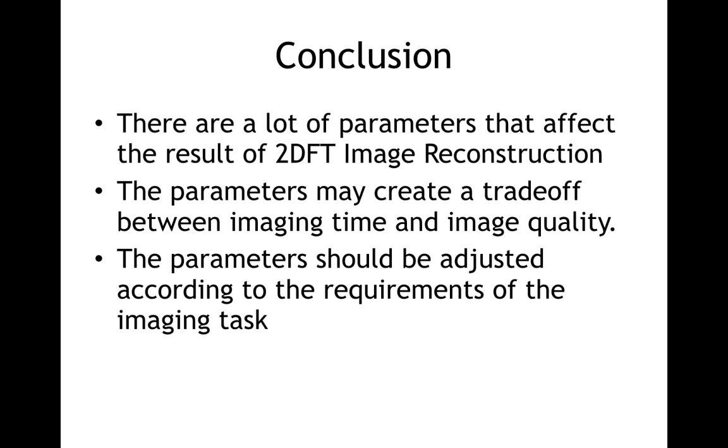Decreasing the resolution or the field of view may result in a lower quality image, however they gain on the imaging time, both in real life and in MATLAB. Sometimes faster imaging may be needed, therefore one may consider giving up on a high resolution image to obtain immediate results. The parameters should be adjusted according to the requirements of the imaging task.